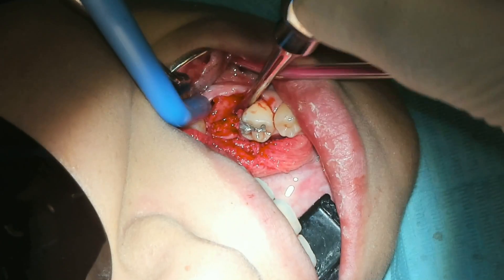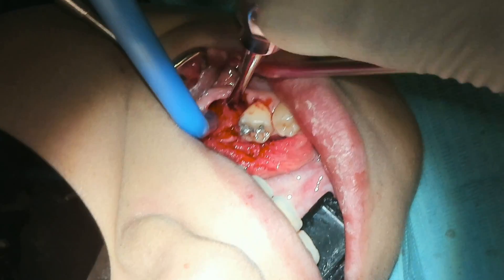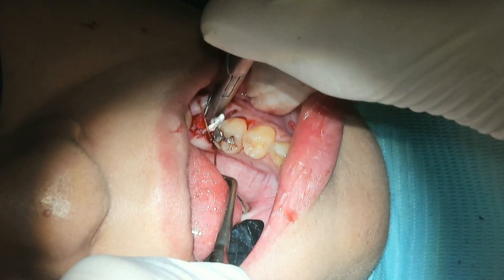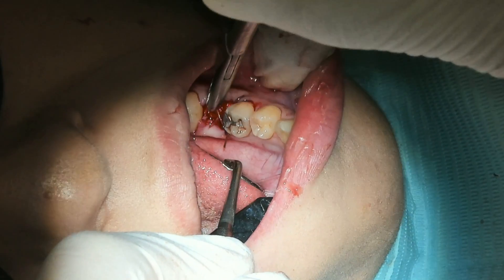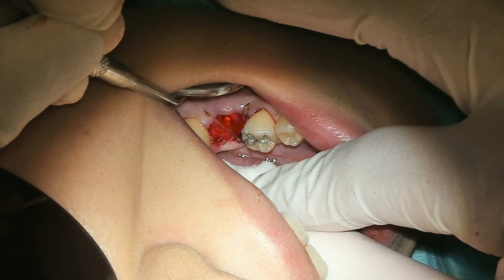Then we curettage very well, irrigate very well, and make sure all that granulation tissue is out. We go ahead and suture and place some gel foam, and eventually remove that little extra suture material on the mesial lingual. And that's pretty much it — nice and clean.